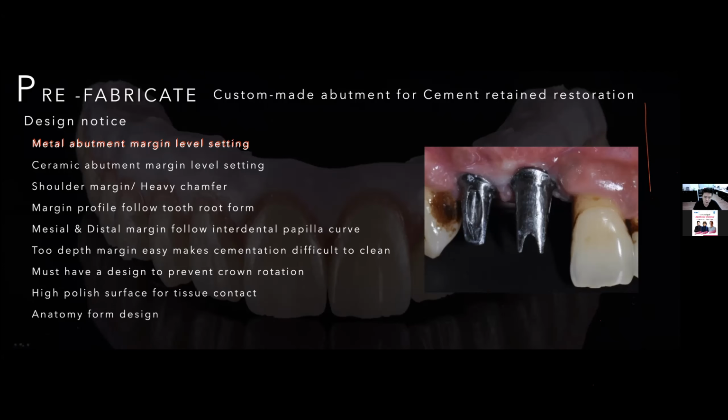Because when dentists remove the temp or the healing abutment and screw the cosmetic abutment in the patient's mouth, sometimes the tissue is not very stable. There is a little change. Maybe the first try is very nice and under the tissue by maybe 1 millimeter, but maybe next time when you finish it, it is just under 0.5, or it will become even.